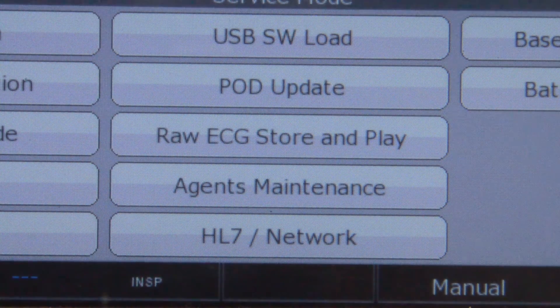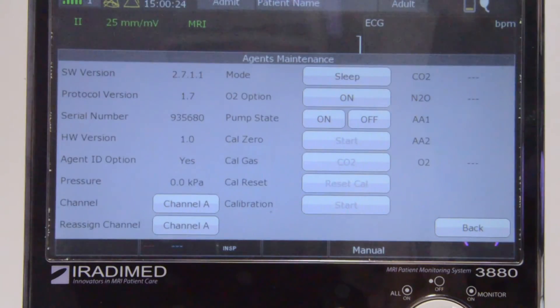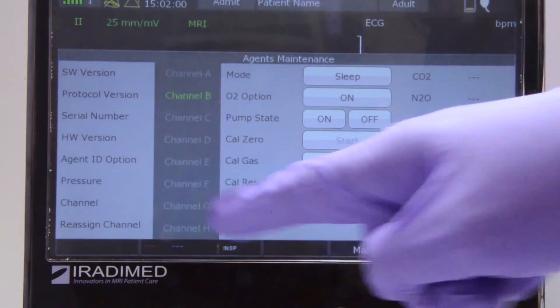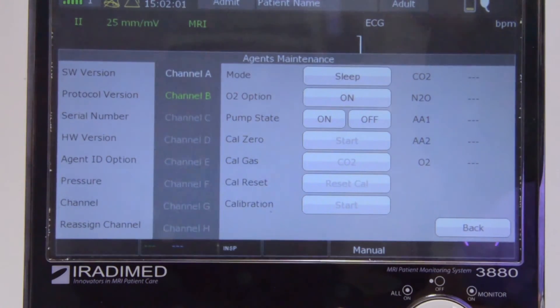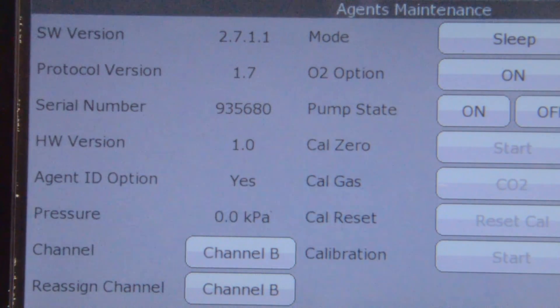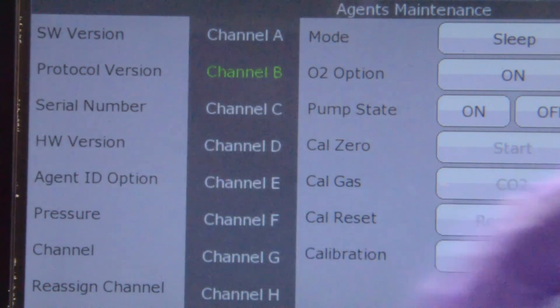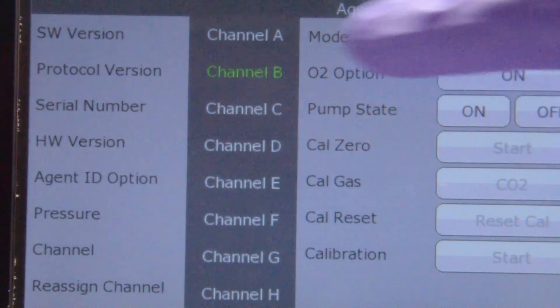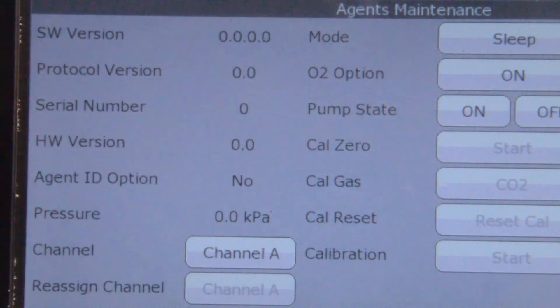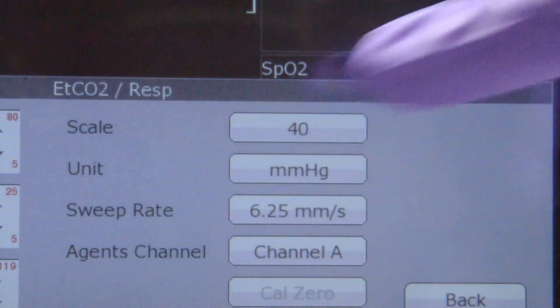The user will then click the agents maintenance menu. The user must ensure the 3880 is communicating with the appropriate 3886. If the user needs to communicate to a different module, click the channel button on the bottom right and a drop-down menu will appear. Select the channel that is in white text to communicate with the multi-gas module that needs to be changed. The user will then click the reassign channel button. A drop-down menu showing available channels will display, and the user will select the available channel for the 3886. Confirm the channel by repeating step 2 from this video.